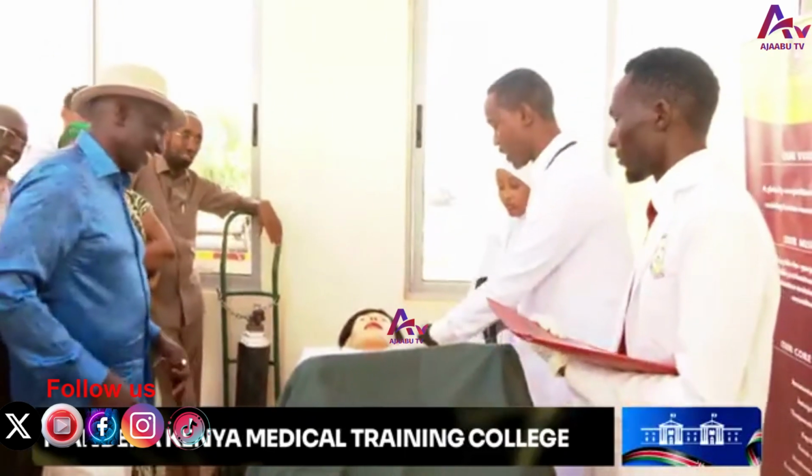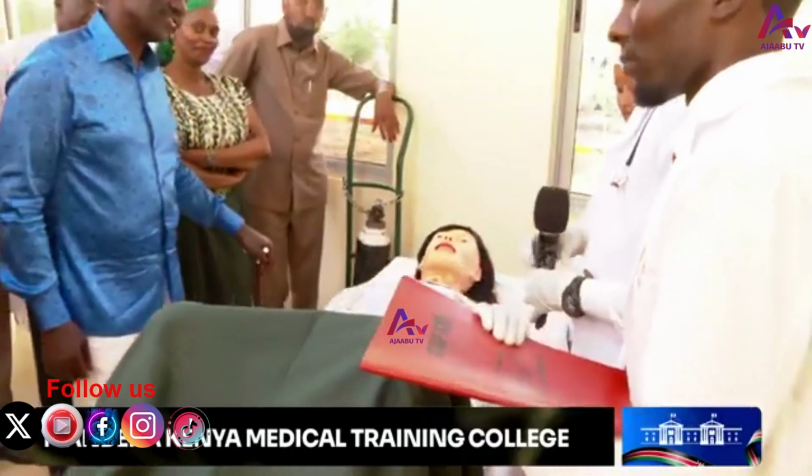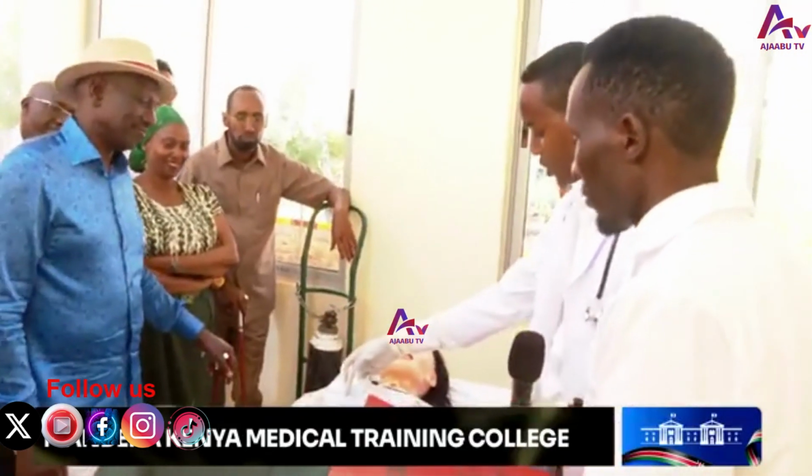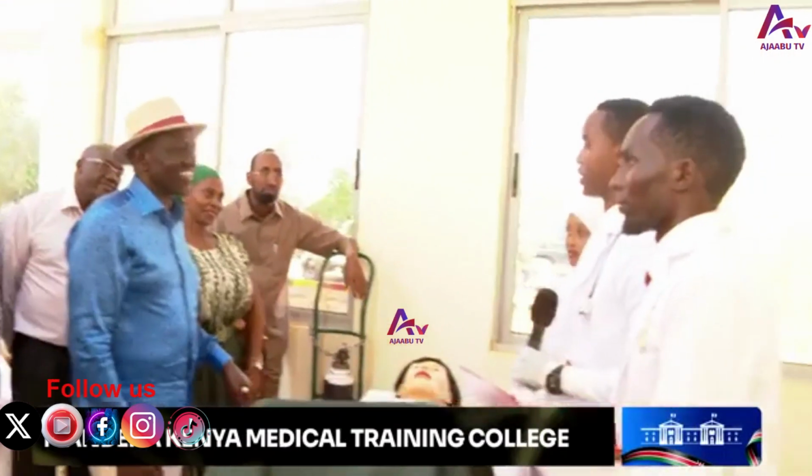So this one is a urine bag. We will accumulate the amount of fluid that will come from the bladder, and we have the ranges here. It will help us in knowing how much fluid we got from this patient. And that is how the procedure is, Your Excellency.